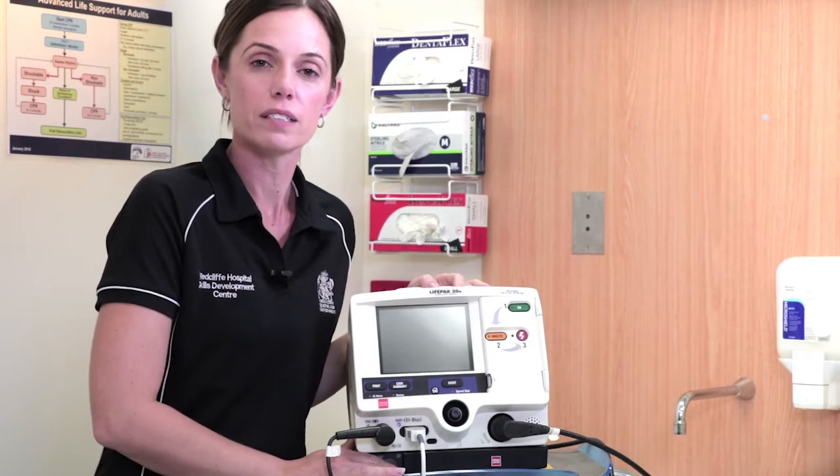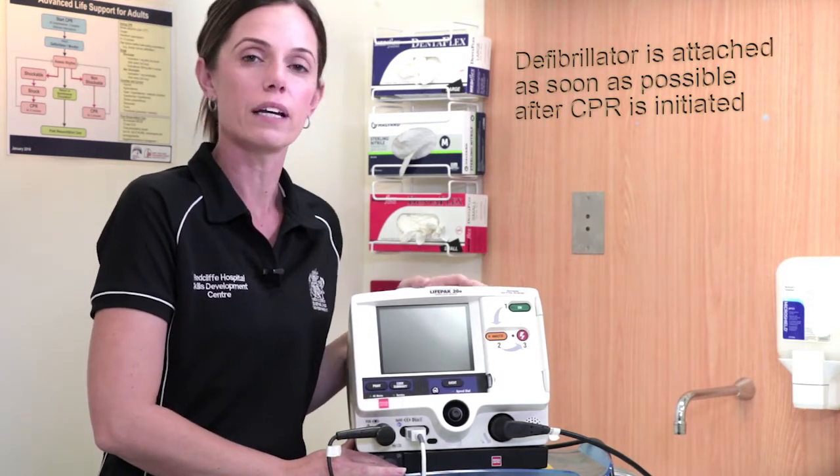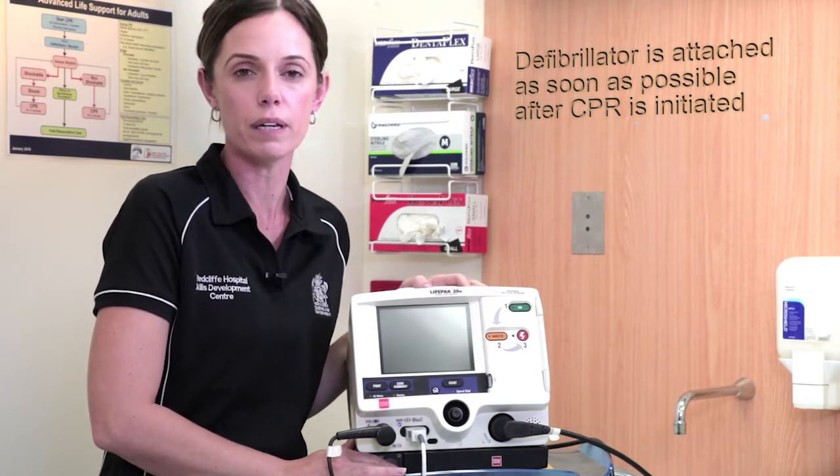As per the 2016 advanced life support algorithm developed by the Australian Resuscitation Council, the defibrillator is to be attached as soon as CPR is initiated.